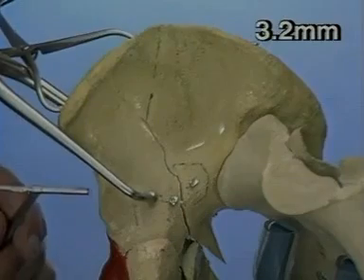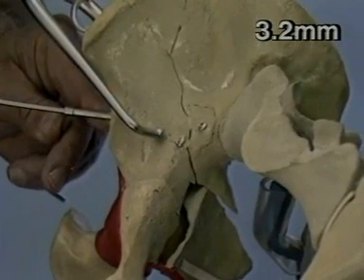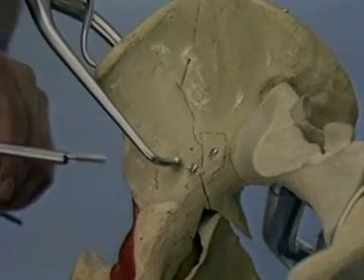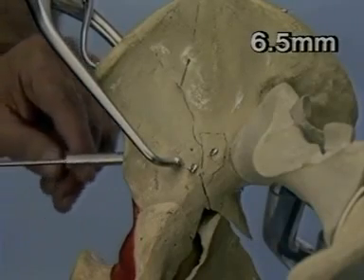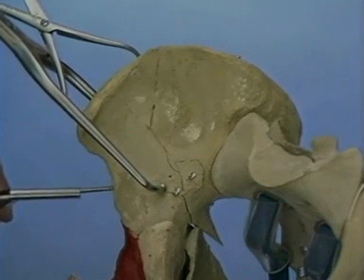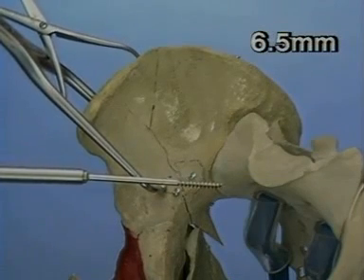A long 6.5 mm screw will be started just lateral to the anterior inferior iliac spine and directed just above the greater sciatic notch. The 3.2 mm drill bit is used. The depth is measured and the 6.5 mm tap used. The 32 mm thread 6.5 mm screw is inserted.